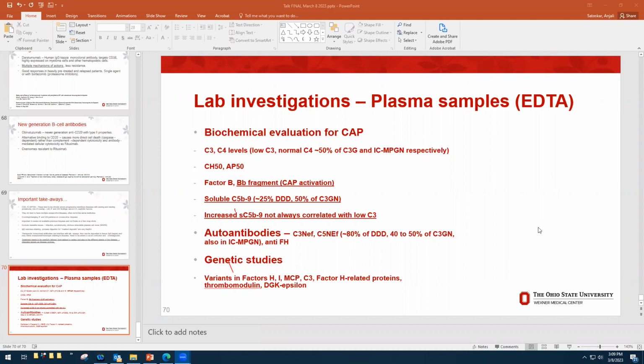Yeah, the first biopsy had shown a lot of IgG staining, if you remember. Yes, I remember. And that is what we are discovering now, that these patients can start with what we would call an immune complex mediated GN, and then they shift along the way to a C3 dominant GN. Also, according to the latest paper and findings from Mayo, the link between C3 and the monoclonal gammopathies is getting stronger. But what's amazing in this case is that she's so young. This is usually a concern in patients above 50 years old, but to start with this scenario at 17, you wonder what is the real culprit here?